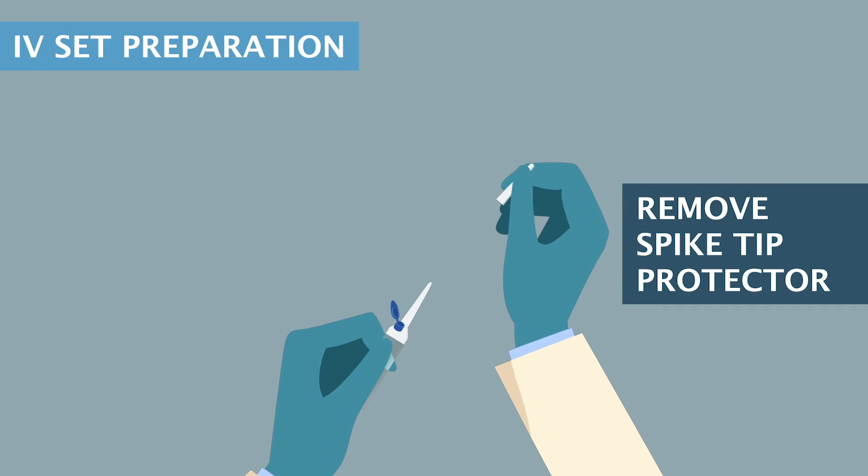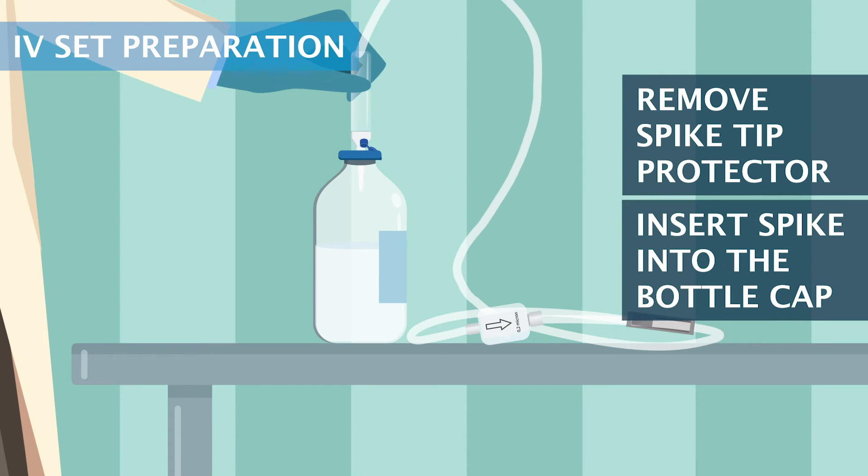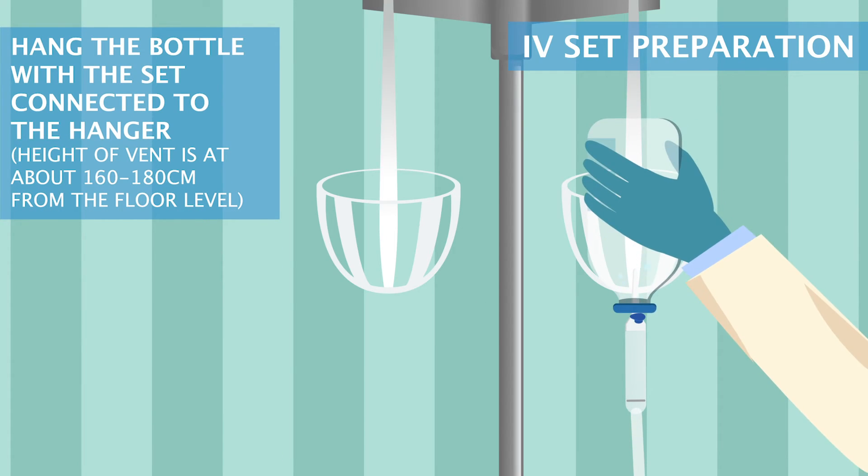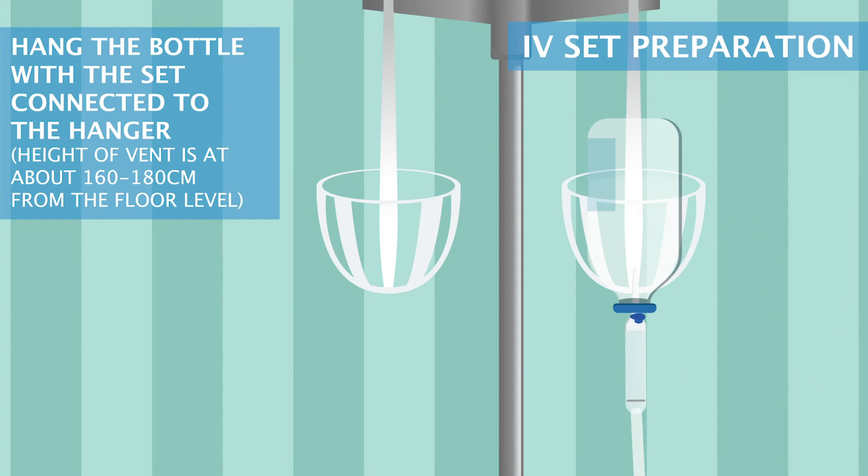Remove the spike tip protector and insert the spike into the bottle cap. Close the vent, then hang the bottle with the set connector to the hanger. The height of the vent should be about 160 to 180 centimeters from the floor level.